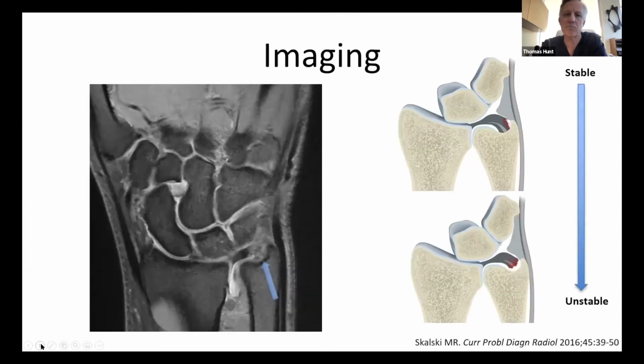Next, please. So here's his MRI scan. And you can see on these coronal images, he's got some scarring. He's got injury to the peripheral portion of the triangular fibrocartilage. Now, I can't tell from this whether it's the deeper fibers, those that provide the greatest stability, the insertion side of the radial ulnar ligaments, or more superficial, more capsular fibers. And clearly it's a continuum of stability. So every type or class 1B tear such as this isn't terribly unstable. His was somewhere in the mid portion of that. Next, please.